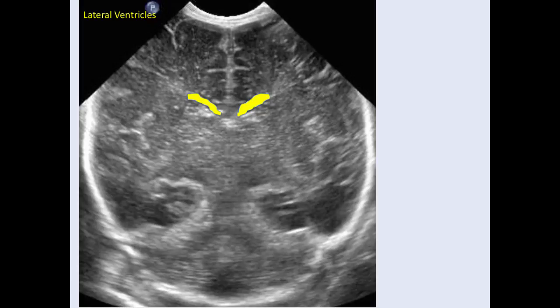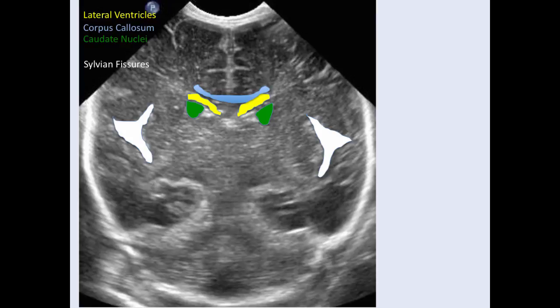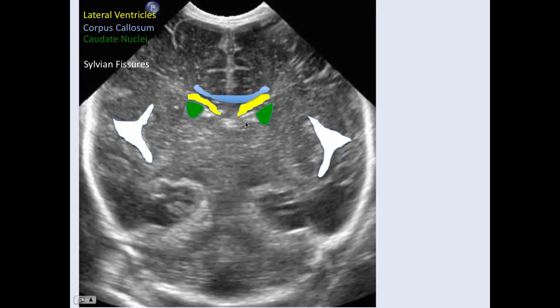Slightly more posteriorly, again we have the lateral ventricles, the corpus callosum directly above the lateral ventricles, and caudate nuclei off to the side and inferior to the lateral ventricles. Sylvian fissures are off to both sides of the brain. We have normal choroid at this level. At this particular position we see the three bright dots of choroid plexus — this is what's termed the three dot sign, a normal finding. We have choroid plexus within the floors of the lateral ventricles and in the roof of the third ventricle, and on this image we see them all together.